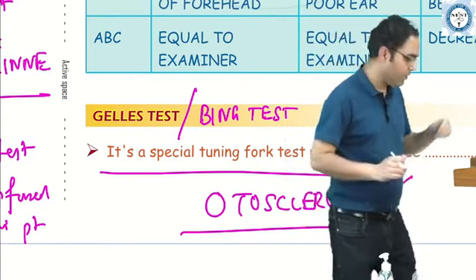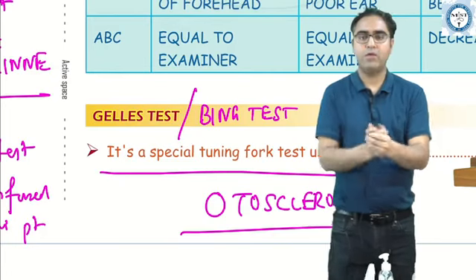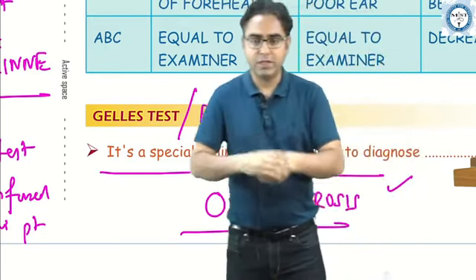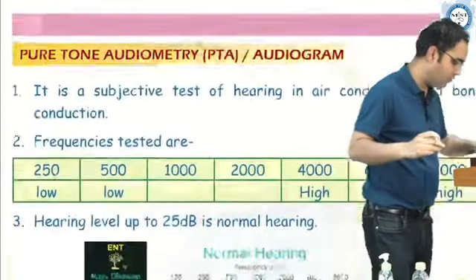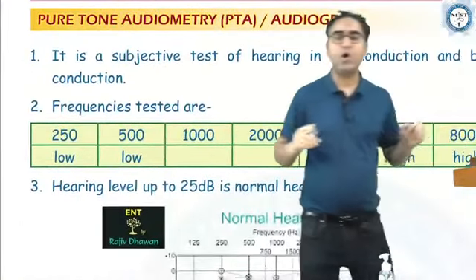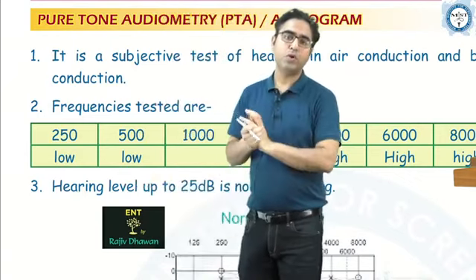Chalo guys, now welcome back. Now we are going to do the next part after tuning fork testing. Let us do the next discussion of pure tone audiometry, beta. The next audiology testing is pure tone audiometry. Now, what is pure tone audiometry?